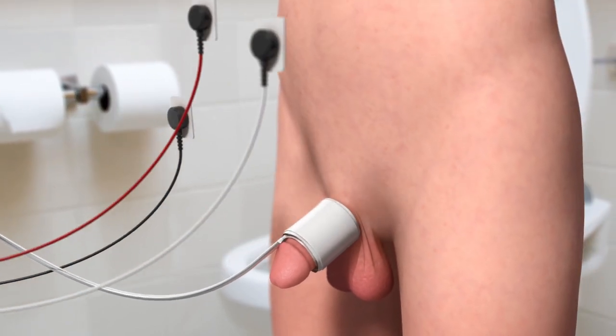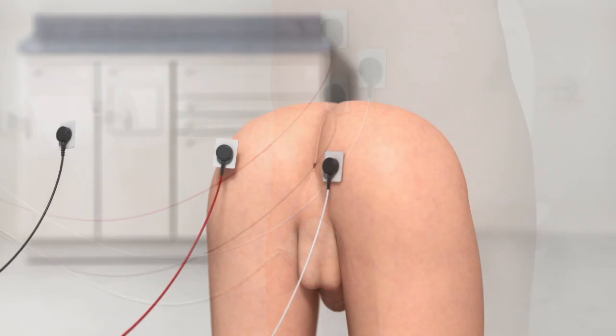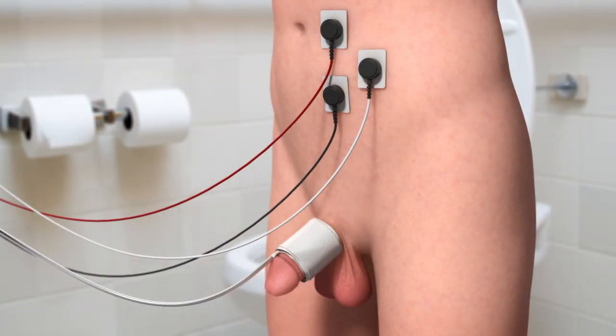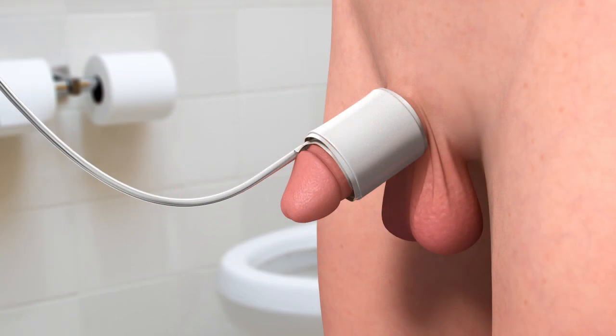Surface EMG electrodes can also be applied to both the abdomen and perineum. The UroCuff software automatically analyzes the EMG signal to identify dyssynergia and abdominal straining.